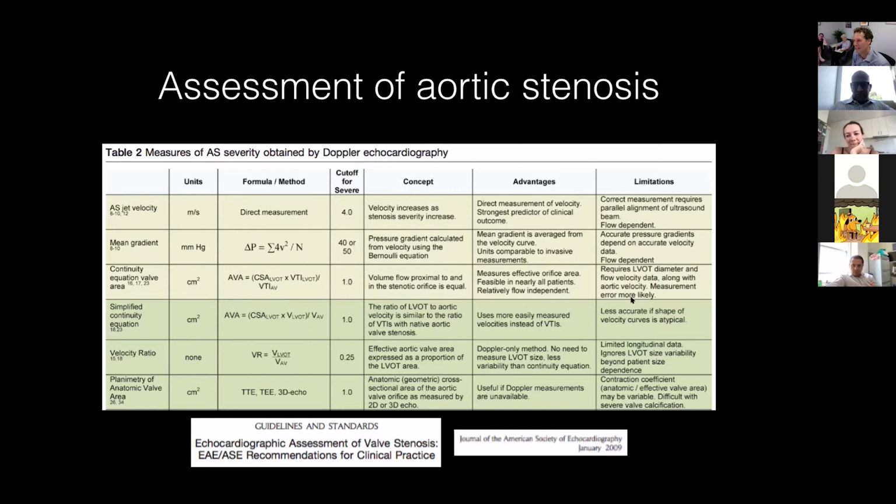If you're doing the ASE exams, they love asking about pressure recovery. Clinically, I don't think it makes much difference. The area where it might make a difference clinically is someone with paradoxical low flow stenosis, in elderly small patients, because such small changes can make a bigger difference. We'll go through that maybe at the end, but I don't think it makes much of a difference.